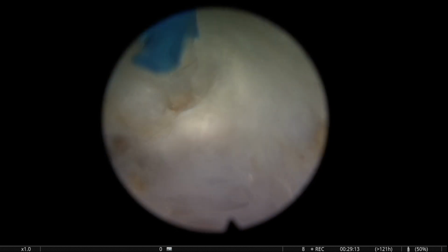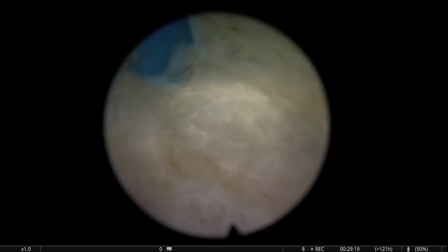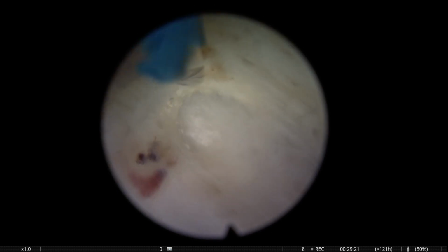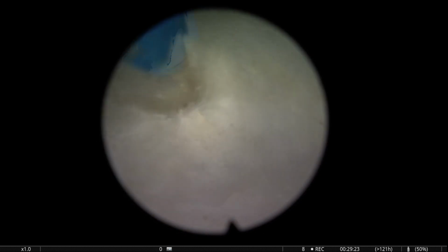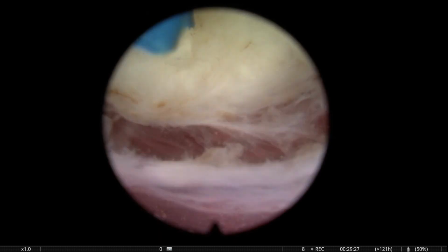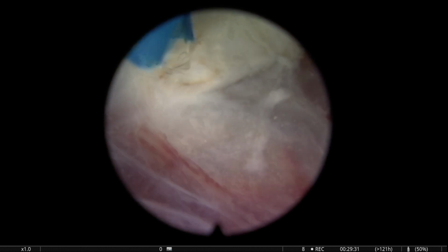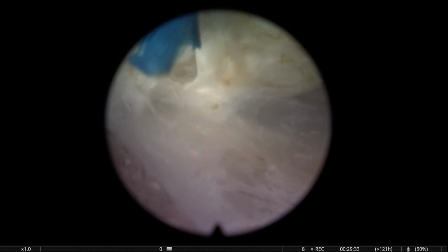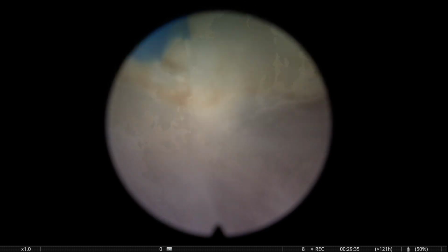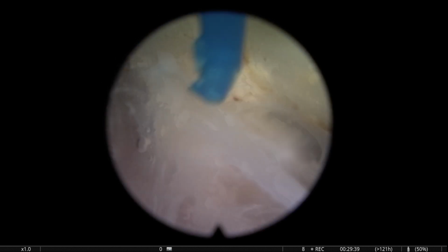So there we are, trying to finalize the posterior dissection, always keeping, you know, that's another subtrigonal nodule. You see that? This is a big nodule here. I keep my laser up, there you see, to try to stay and leave some capsule or some capsular elements.